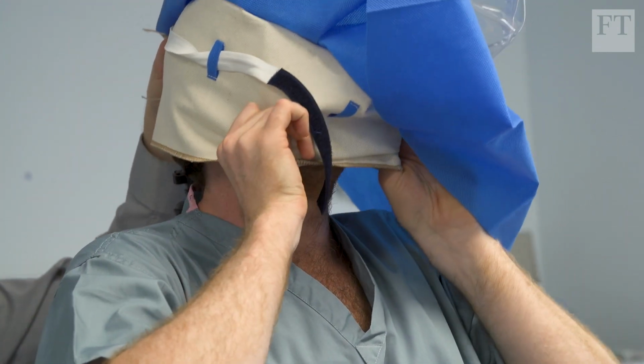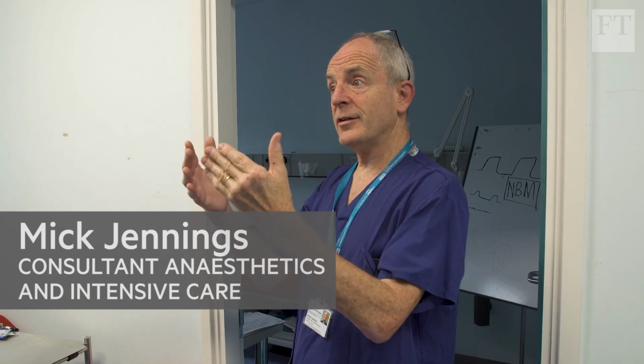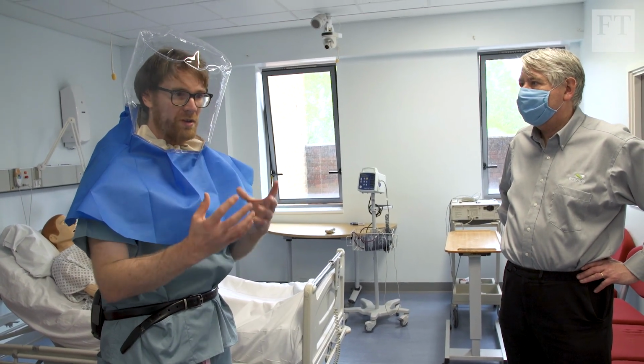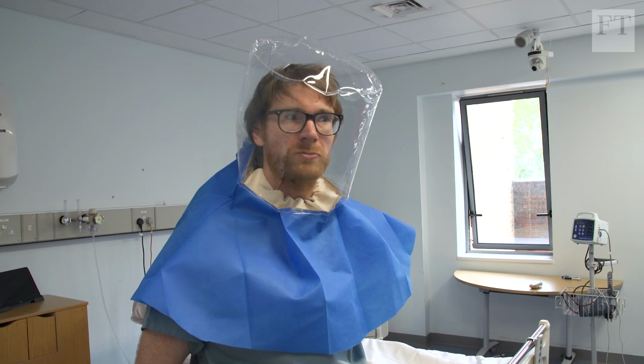When I first tried it, what I was a bit concerned about was that the optics through the plastic wouldn't be good enough for like intubation or something like that. There is obviously some element of looking through a filter, but it's actually quite clear. And the acoustics is pretty good too, isn't it? Sorry, what?